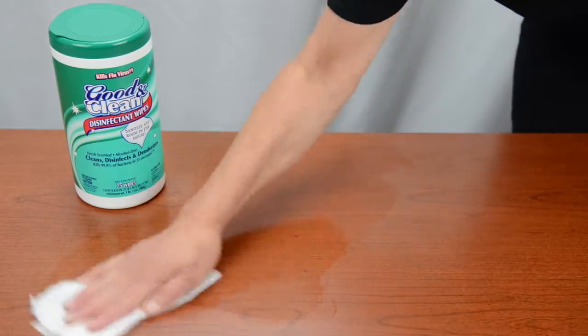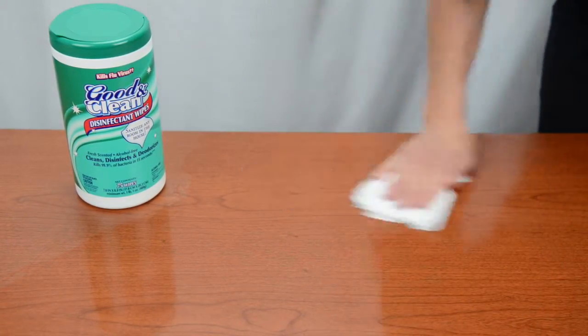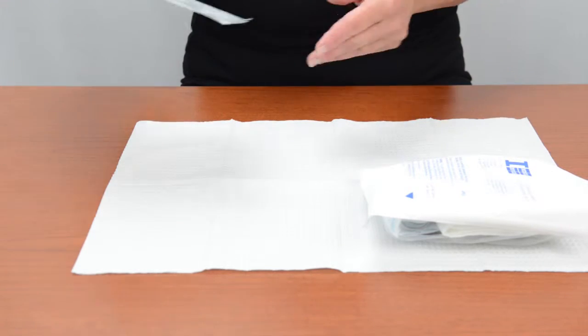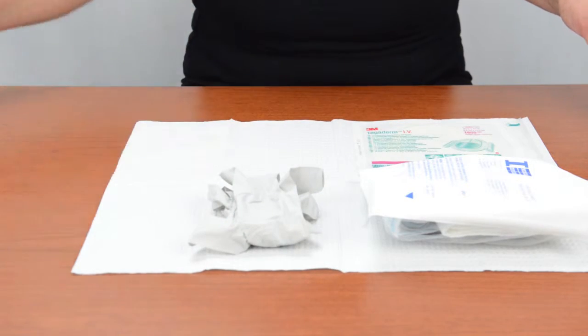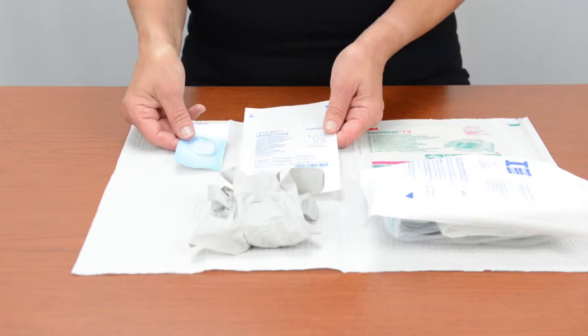Clean your work surface with soap and water or a disinfecting wipe to create a safe zone. If you'd like, cover your work surface with a clean paper drape. On your safe zone, place a bandage change kit, a clear bandage, a pair of non-sterile gloves, and, if they are used on this patient, an anchoring device and biopatch.